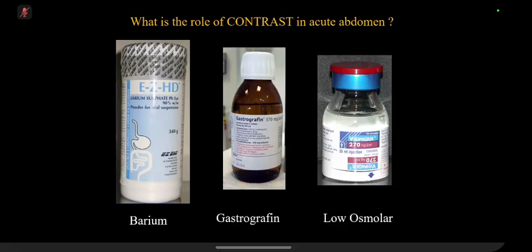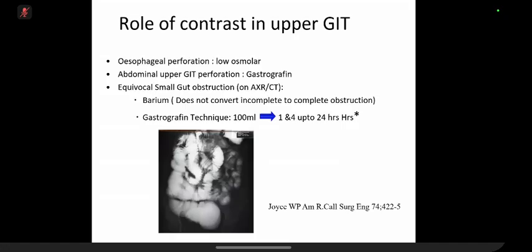Gastrografin has a national shortage right now, and you might have seen that. So we are improvising and using Omnipaque, and we are developing new protocols because of that in GI also. There are a lot of technicalities because these come in various concentrations, 270, 370. But this is the take-home point, a pass and fail type of scenario.